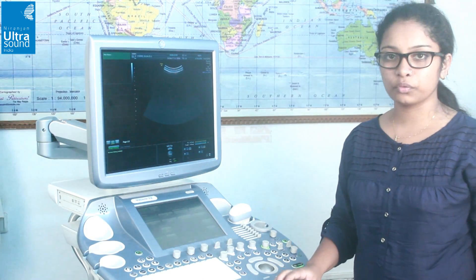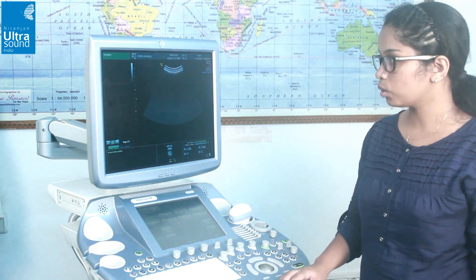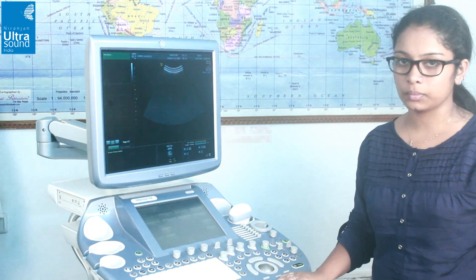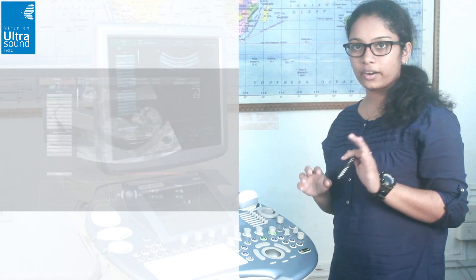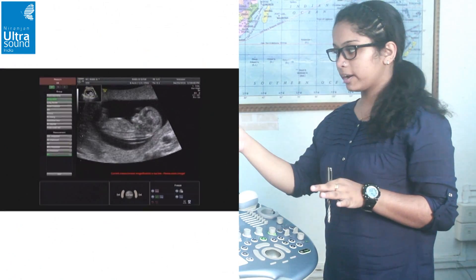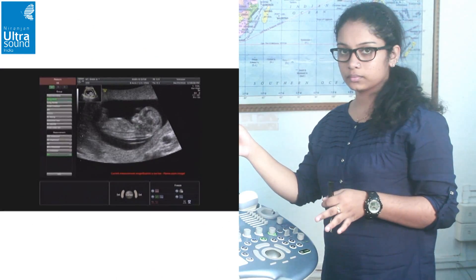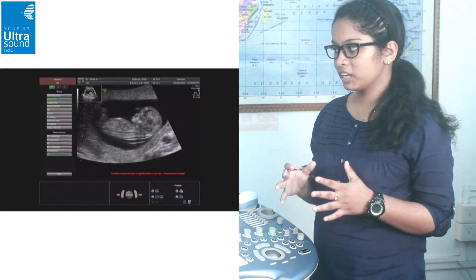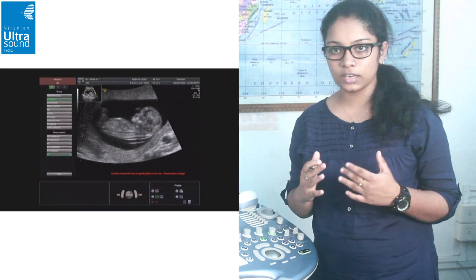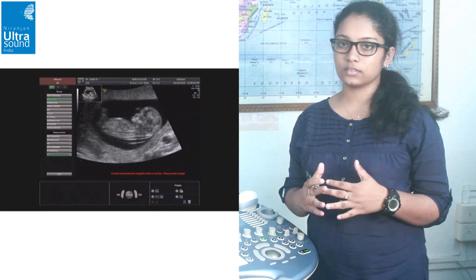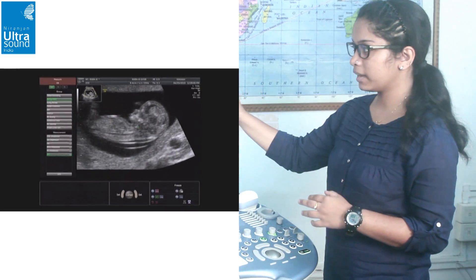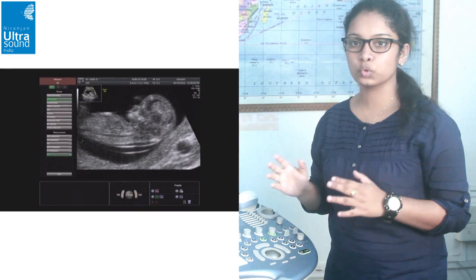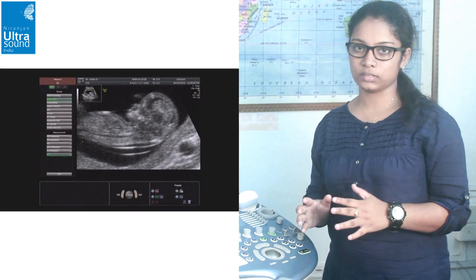Now we have a choice of doing manual or Sono NT measurement. A red warning is displayed on the screen indicating that the image magnification is insufficient, so we enlarge the image and first do manual measurement.